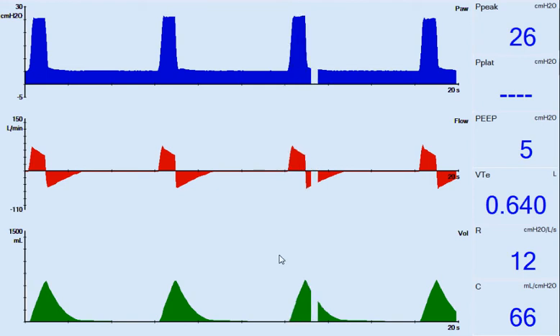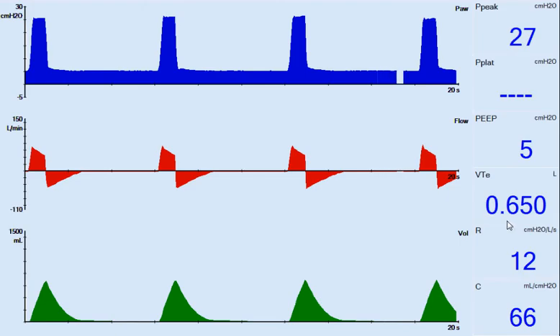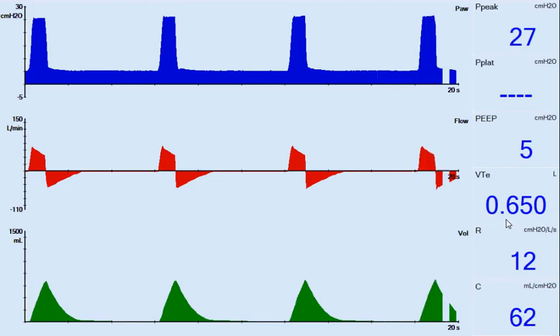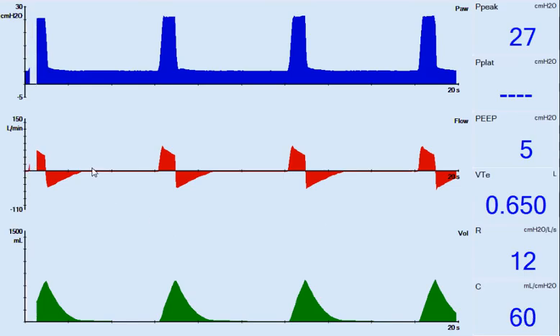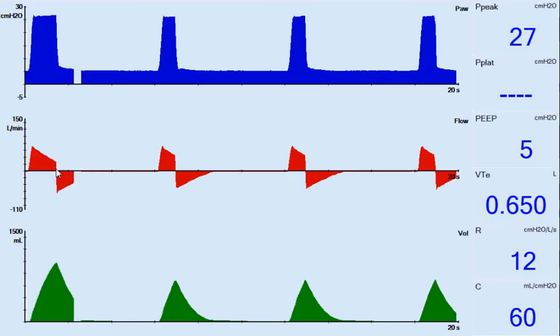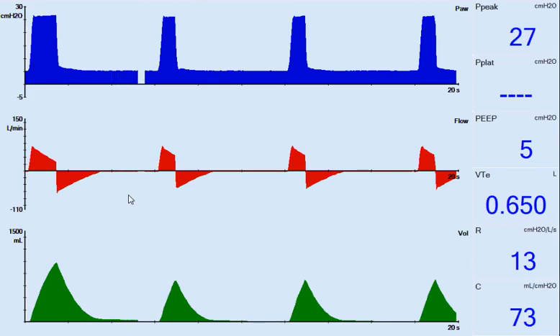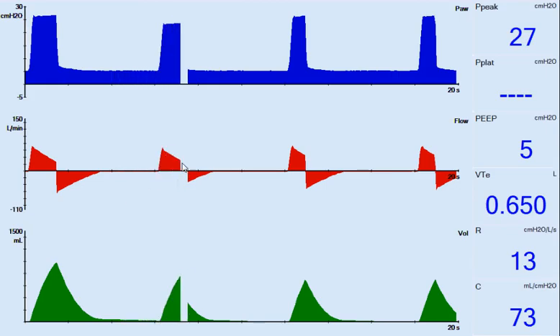At this time, it's currently taking a peak pressure of 26 to 27 to get the 650 tidal volume. Notice the resistance and compliance won't change. During the next couple of breaths, the inspiratory time is going to be increased, which will create more deceleration.